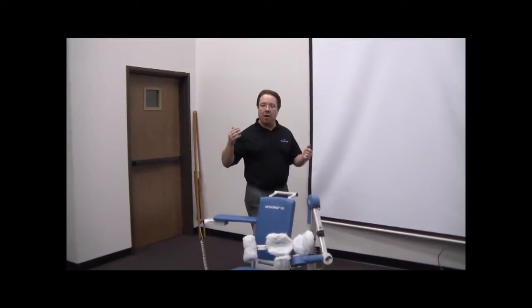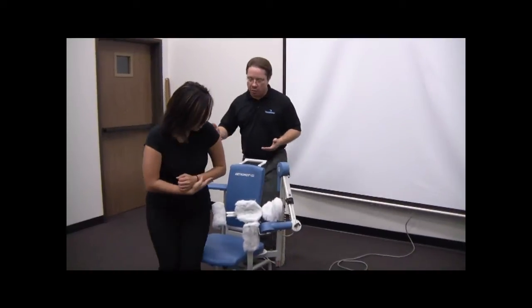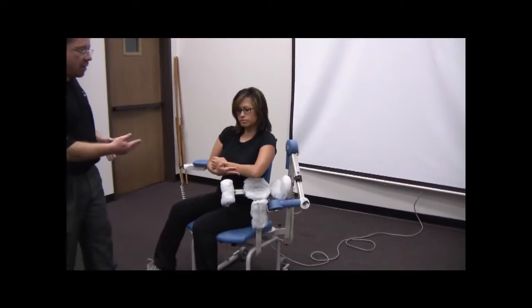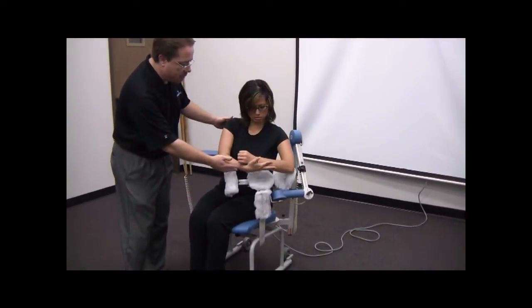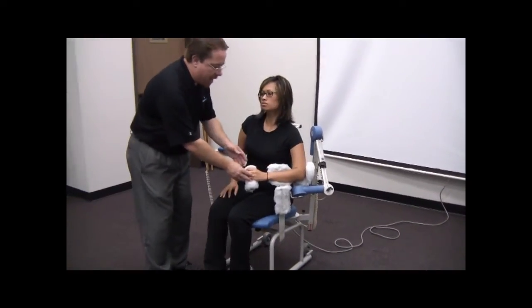Right, now we're going to have our patient, Ann, come on in, and we're going to fit her to the CPM. So we're going to have her sit in just the way that we explained. We're going to have her square herself in the chair, and lay her arm into the orthosis like that.